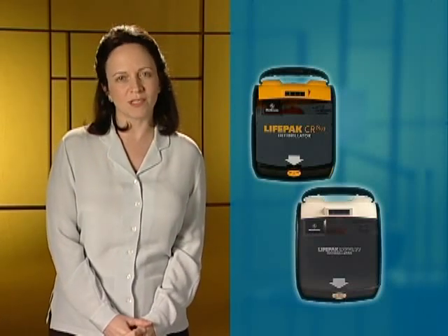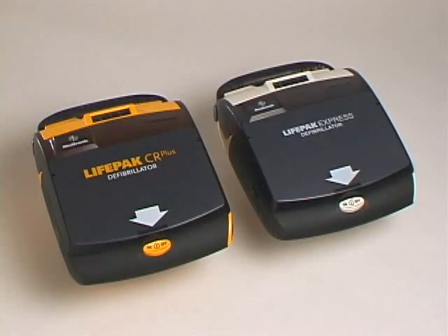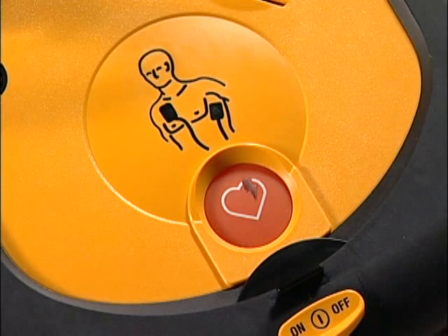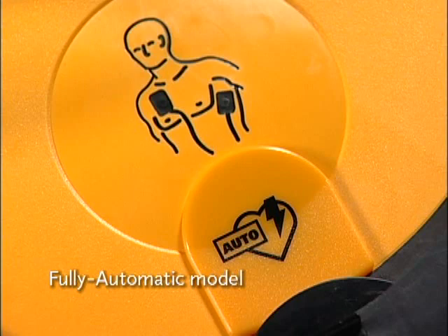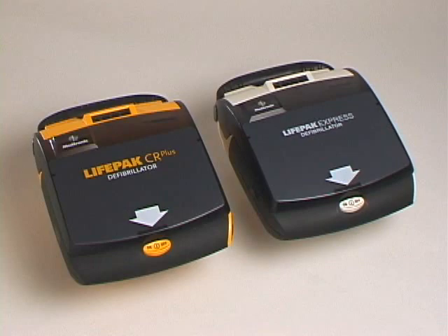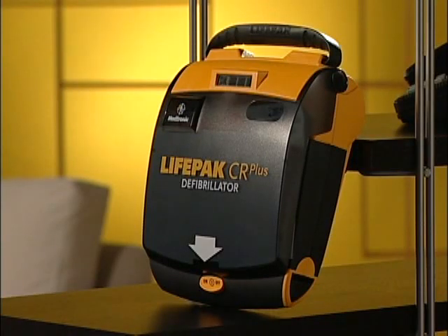We'll go over the steps you should take to try to save that person's life. This video covers the operation of two LifePak AEDs: the LifePak CR Plus and LifePak Express Defibrillators. The semi-automatic model has a shock button that you press when instructed by the AED. The fully automatic model does not have a shock button and delivers the shock automatically. Because the operation of these AEDs is so similar, we'll use only the LifePak CR Plus AED in this video.